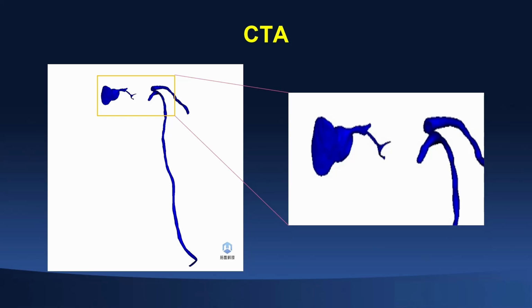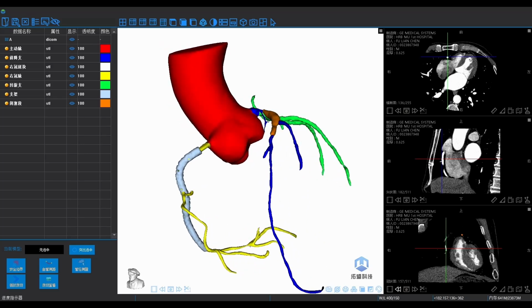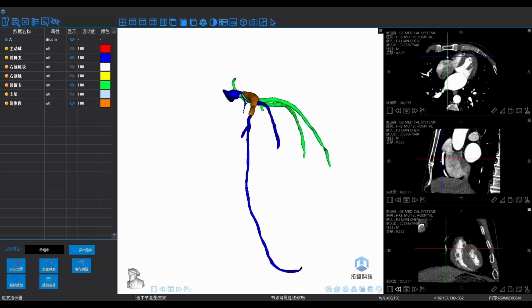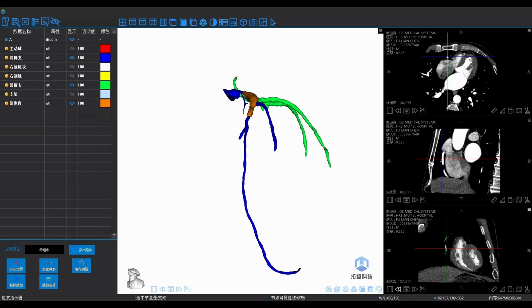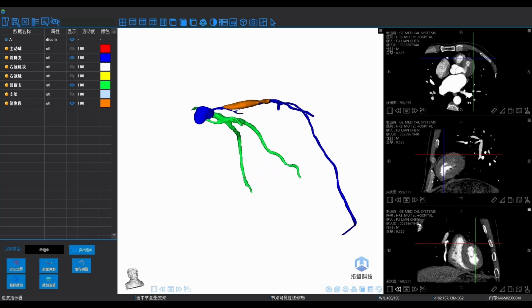And please let Dr. Wang Dingyu show us a live demonstration of this intelligent visualization system, because we can easily rotate in any direction. Okay, you can see, first delete the aorta. Okay, delete the RCA. Okay, delete the stent. So we can rotate, like in the RAO caudal view. Dr. Wang, show us the RAO caudal view. Can you see the circ, the proximal segment, and the brown one is the CTO segment. Delete the brown soft tissue. Okay, we can see clearly.